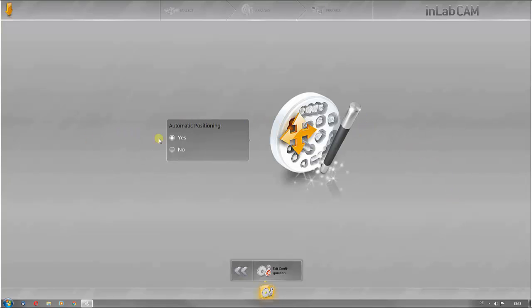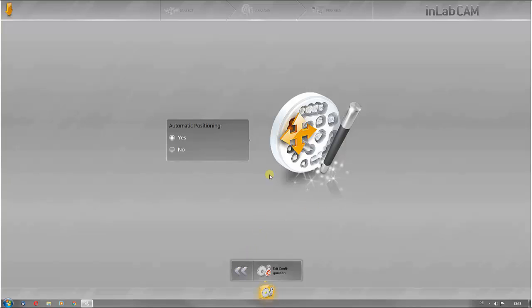Automatic positioning is activated in the default settings. This means all elements are pre-positioned automatically. This can be switched off manually.